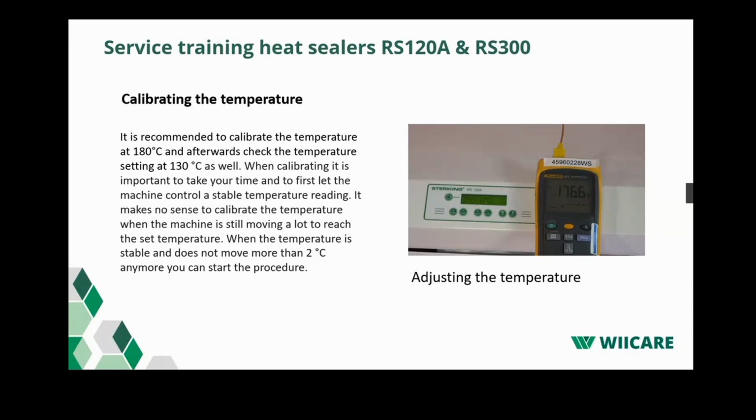In this video, you can see that the service person tried to adjust the temperature, but the temperature was still fluctuating quite a lot. But he did that just for demonstration purposes, so you could see how to set the temperature up and down. We always recommend to set the temperature around 1 to 2 degrees precise.